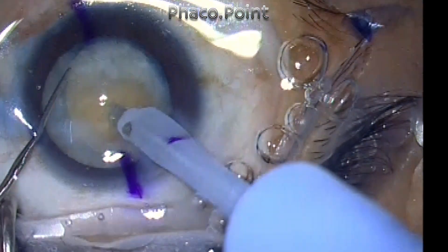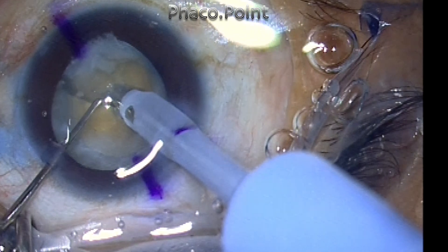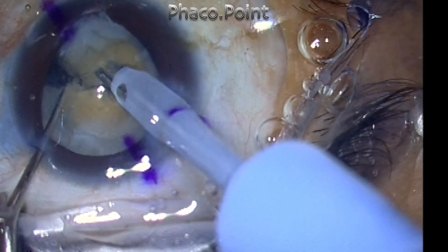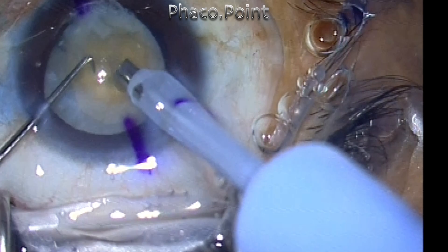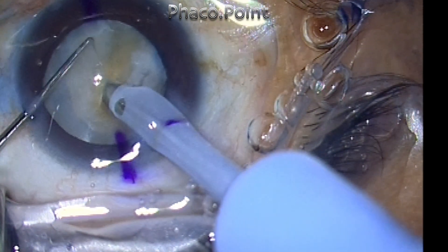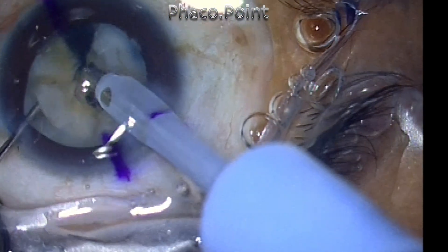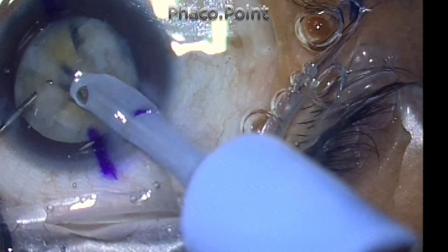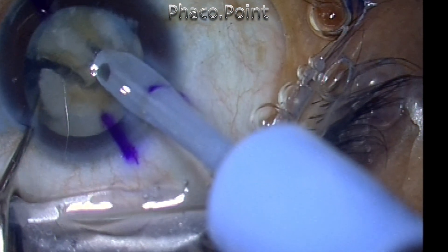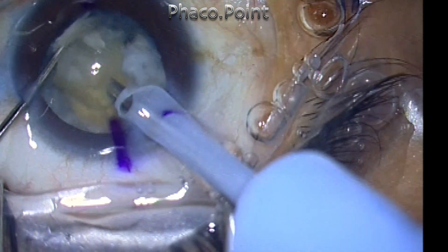Now see what I do. I start the chop not close to the tip, but I go to the mid-periphery, almost to the edge of the nucleus. This is a small nucleus. And once you start near the periphery, it is easy to create the crack. Once the crack happens, you can propagate and extend this by taking the second instrument deep within the groove. And then with very little lateral separation, you can get this nucleus to completely crack.